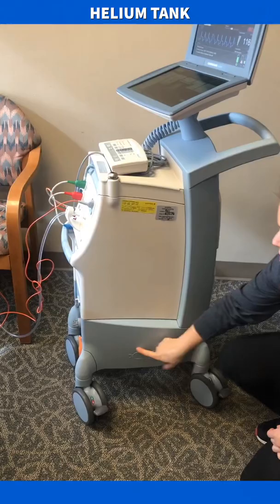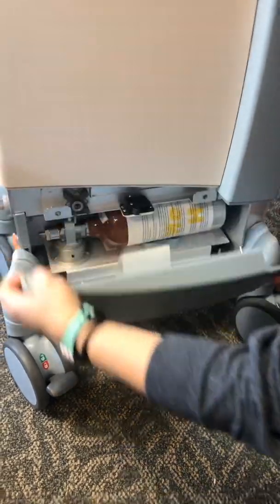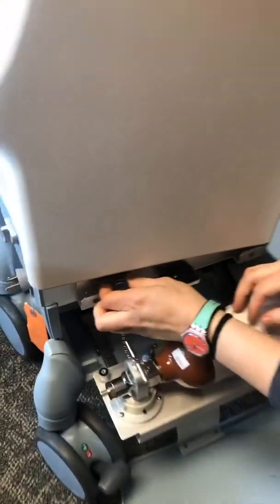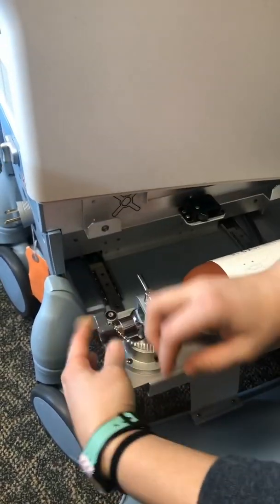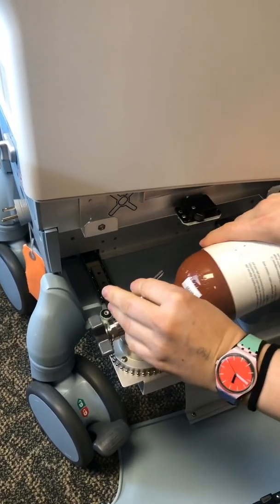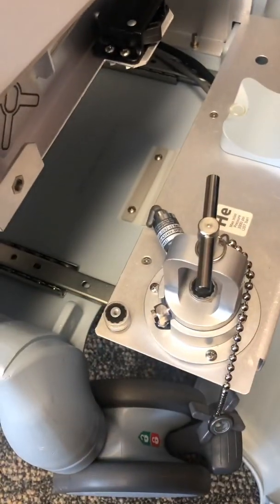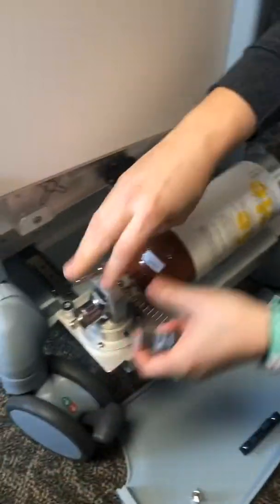Now I'm going to show you where the helium tank is stored. Over here on the side it says helium and there's a tank — you pull the signs over here and it slides out sitting in there on the side. To change it out, same way as the other one, except now it's on its side. First you're going to close off the tank — righty tighty, lefty loosey — open it up, and then you can pull your tank out. There is a little washer in here; if that happens to fall out and roll away, there are extras over here. Then you go ahead and put your new tank back in and secure it down.